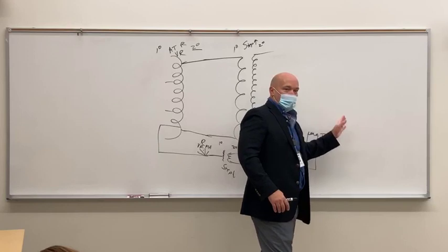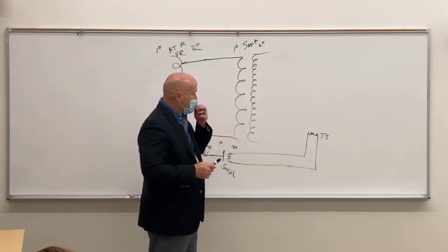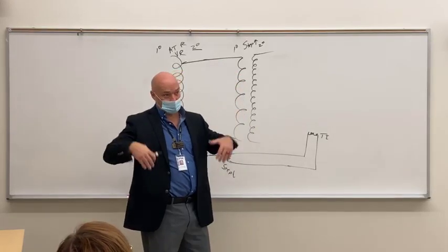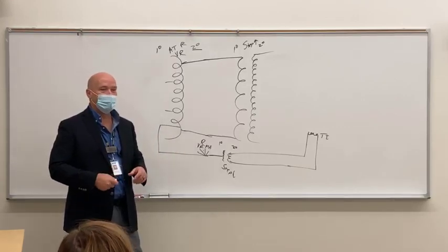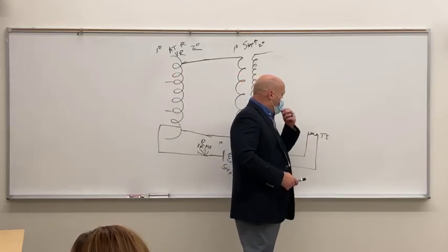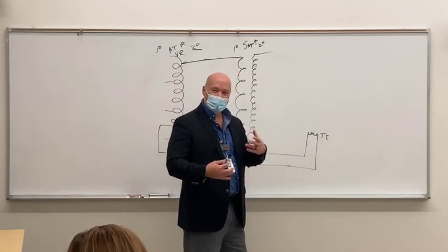We send that heat across the X-ray tube and we bombard the target with heat. But at the same time, compared to the classroom today, what are your X-ray rooms usually kept at? The hospital in general? Cold, right. So what we do is we run a low voltage and low amperage through that filament just to keep the X-ray tube a little bit warm.